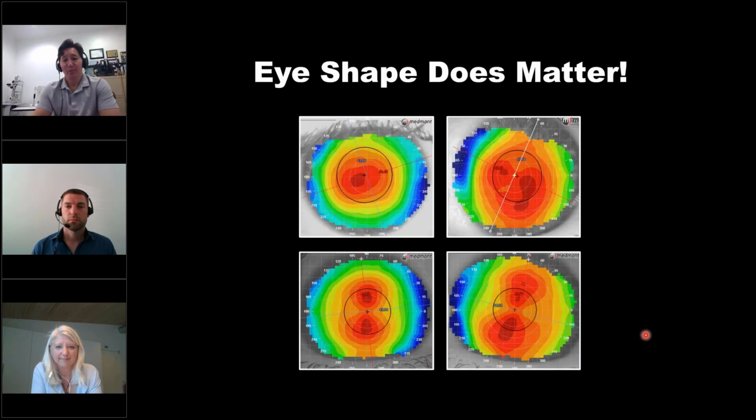Mette brought up a good point that we have to appreciate that we have different eye shapes and different relationships with the refractive cylinder. Clearly, our apical astigmatisms are much easier to manage in Ortho-K, and limbus to limbus is tougher. So that's a factor. It's not just how much astigmatism the patient may have, but it's the shape of that astigmatism and how easy or difficult it is to push out of the way.